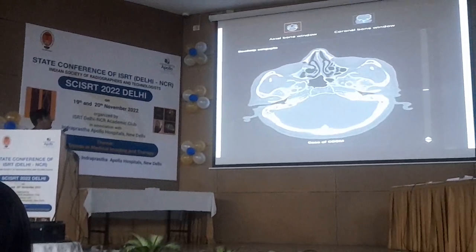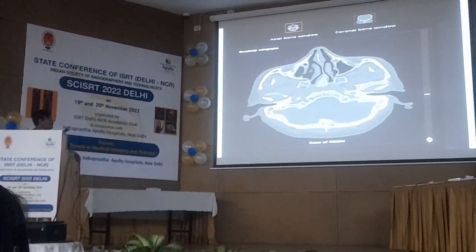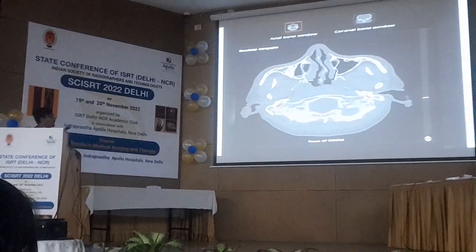So if you find that the malleus joint is intact over there, and in this case the right temporal is affected.